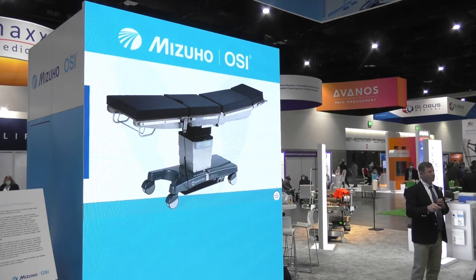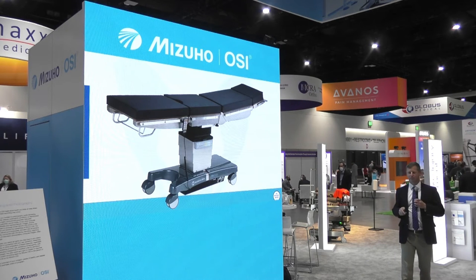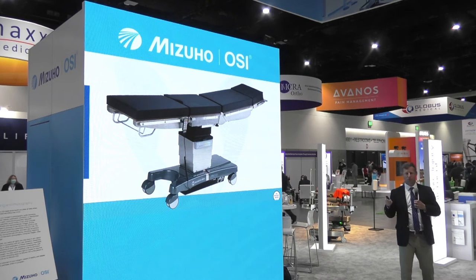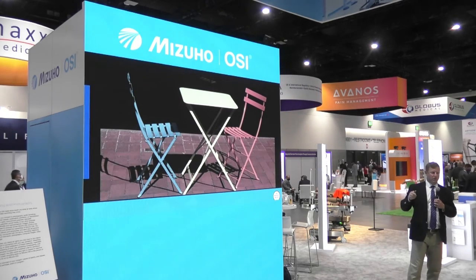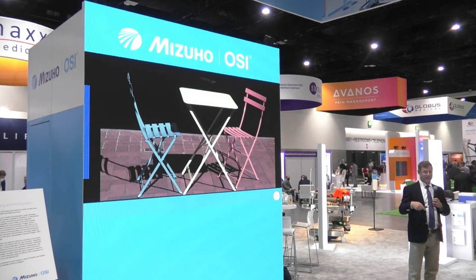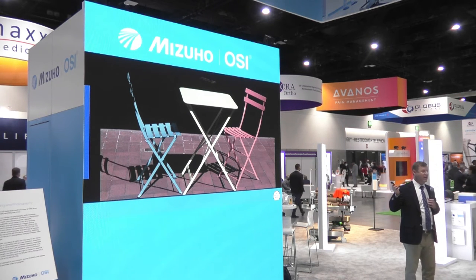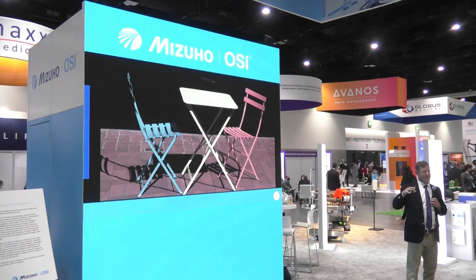But if you want to grow beyond your few surgeons that are doing it off of the table, you will probably need some sort of either extension or table. So you can say, well, we don't want to spend anything. We'll see if the implant manufacturer can bring one of these things in. And these things have about the stability of this picnic table that you see here. I mean, these things are thin. They're typically made of metal.